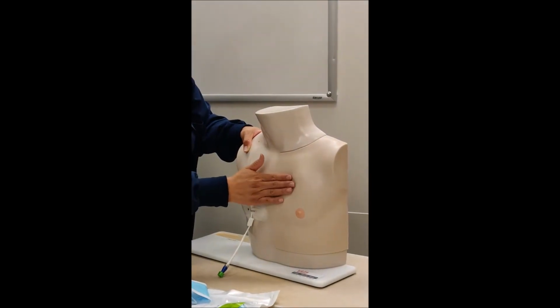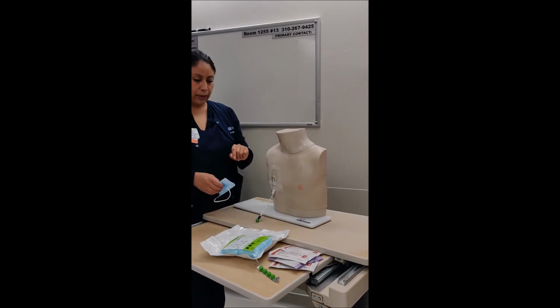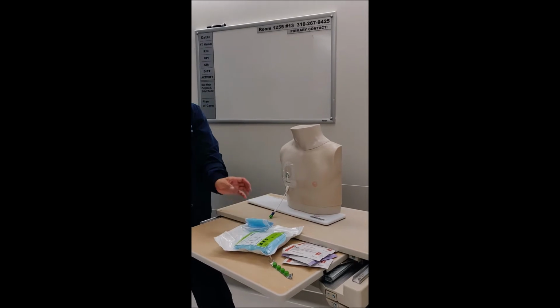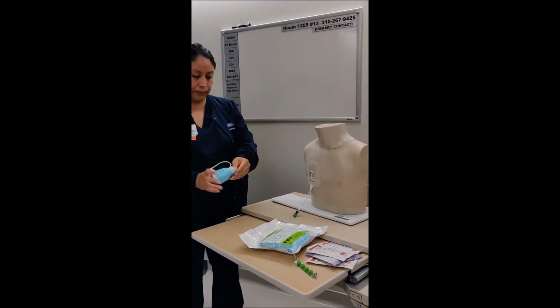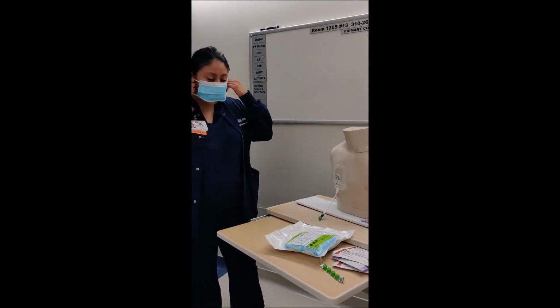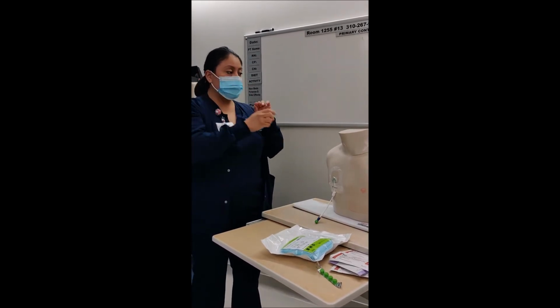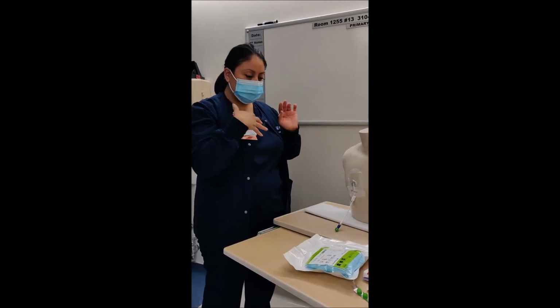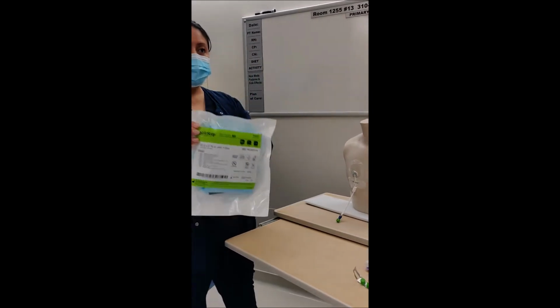So for now, we found our Cath, and then we're going to access the Cath because we're going to draw blood as well. So the first thing is, I'm going to hand sanitize my hands. I'm going to don my mask, and then we're also going to ask the patient to put on a mask as well, and then turn away from the site.